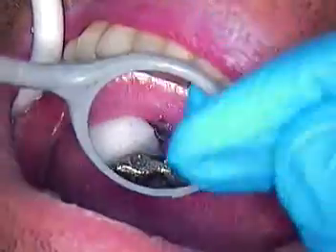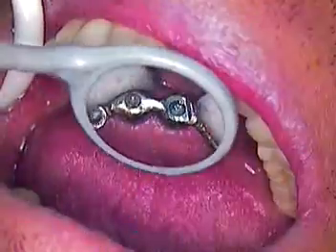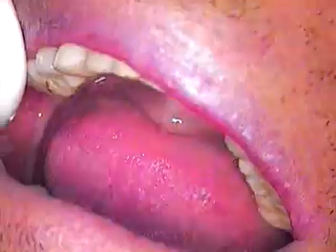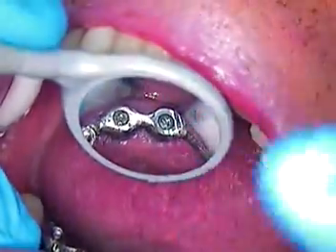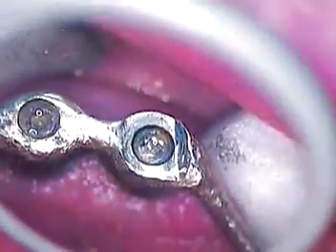Okay. Here it is. Cotton plier. Got it? Okay. We got it. So, yeah, you're in good shape. It's just now a matter of going through the formalities. So I could take the bar off, and I'm going to try to just sneak it out this way. And then I'll put a screw back in there. Microsuction, please. So we don't need this, Robert. Thank you.